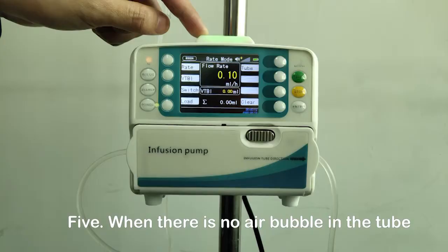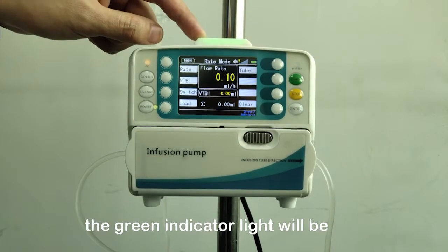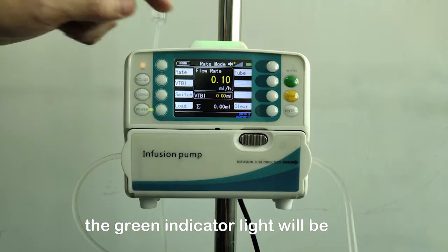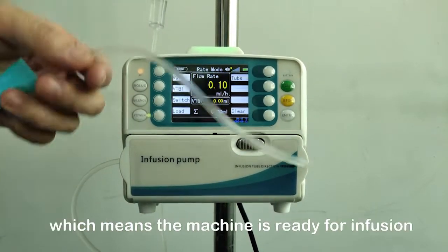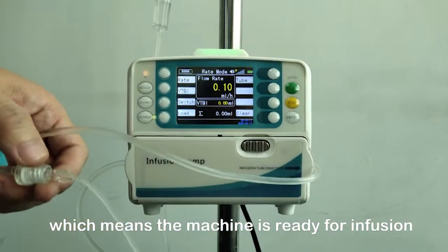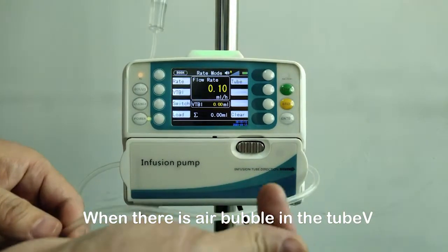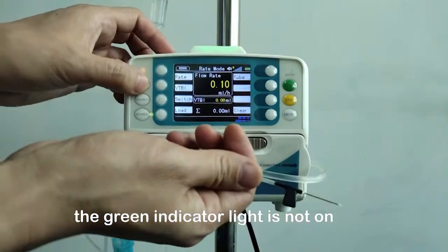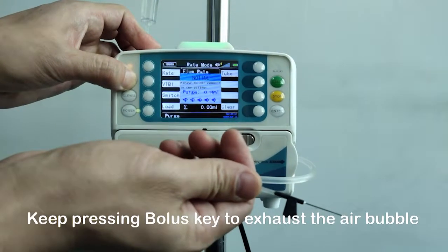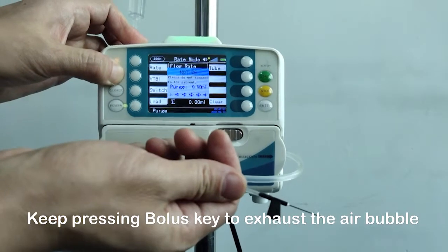Step 5: When there is no air bubble in the tube, the green indicator light will be on after the IV set is properly installed, which means the machine is ready for infusion. When there is an air bubble in the tube, the green indicator light will not be on. Keep pressing the bolus key to exhaust the air bubble.